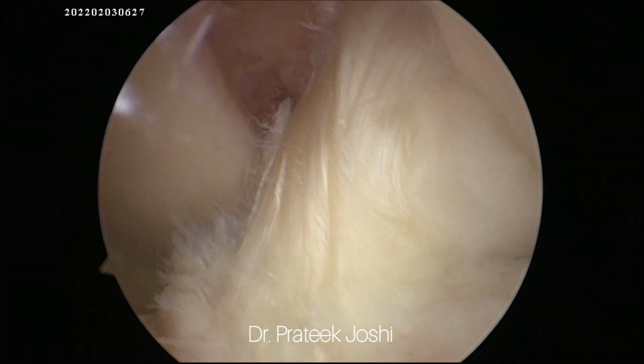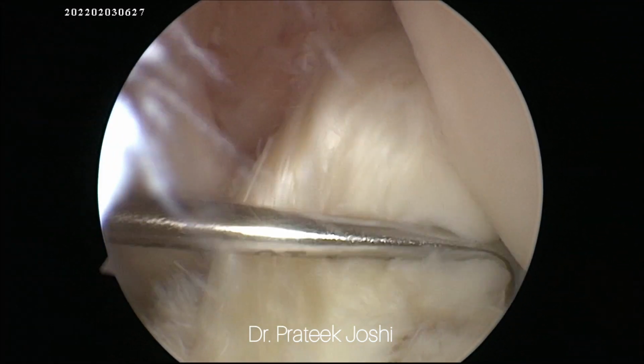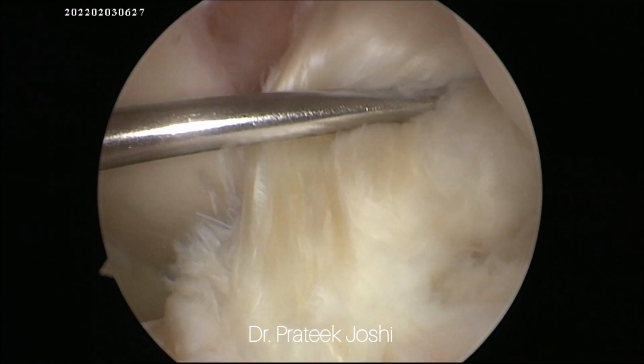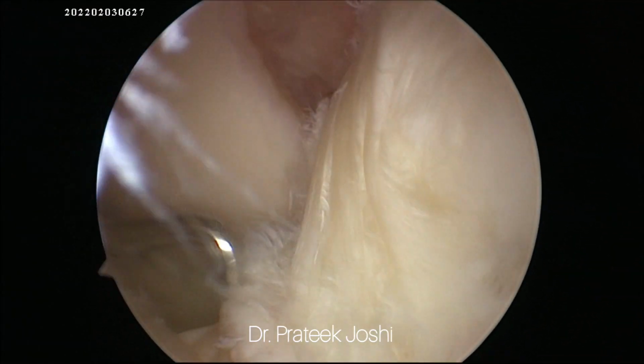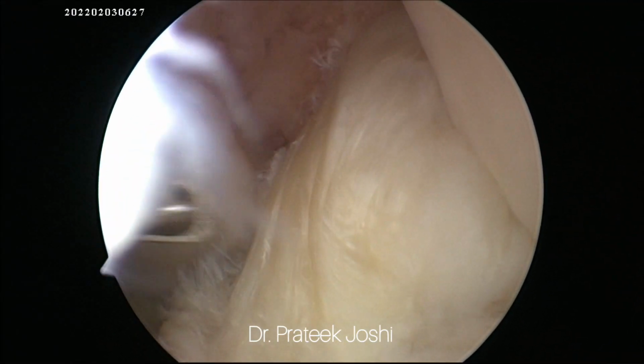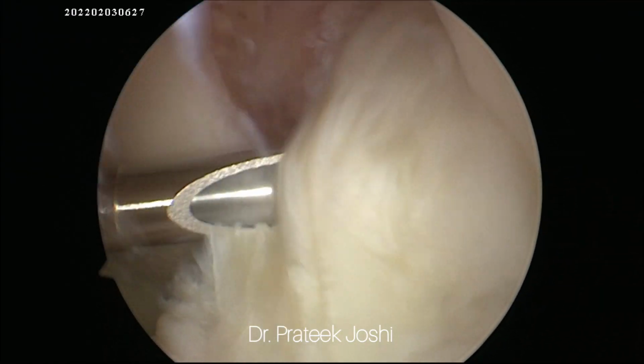So today we have a case of a middle-aged woman with knee joint pain. On MRI, she was found to have mucoid degeneration of the ACL, and there was a complex tear involving the medial meniscus, posterior horn, and body. On standing X-ray, the joint space was good, so it was not a case for any replacement surgery.